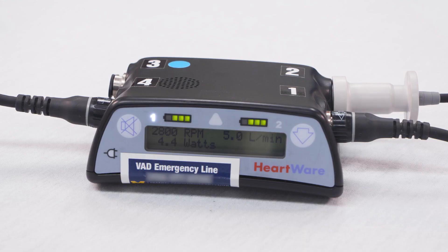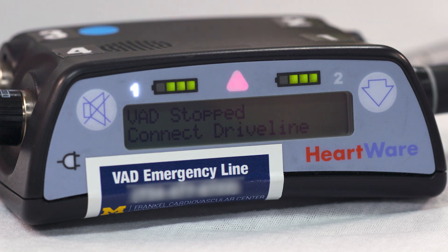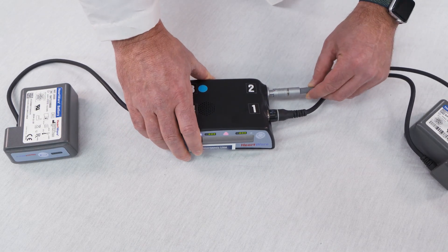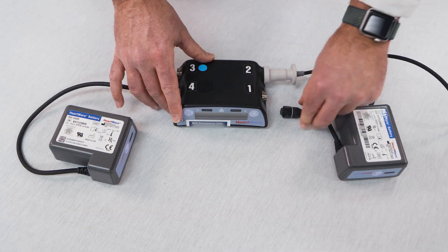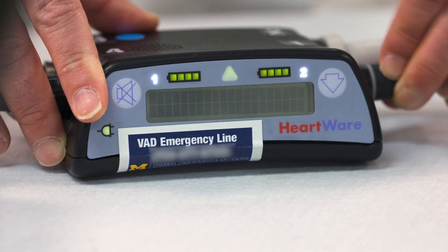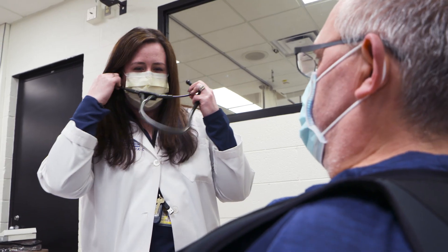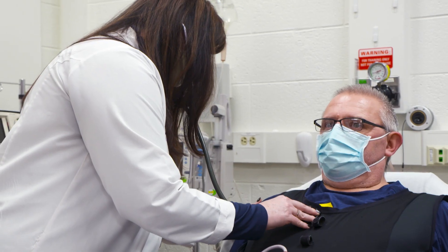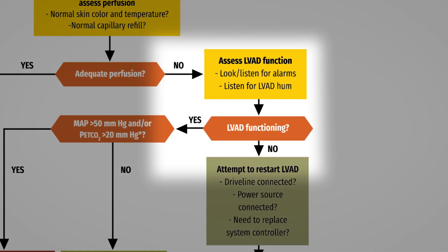For the HeartWare device, check to see if the device is on by checking the screen. If it is off, the screen and lights on the face of the controller will be blank, or it could display 'Connect Driveline.' Here is how to reconnect the driveline and the power supply. Reconnecting the driveline or power supply quickly will resuscitate the patient if the pump was off. You should next auscultate over the chest to confirm the hum of the VAD. If you auscultate, you will hear a sound something like this. This often masks the normal heart tones.